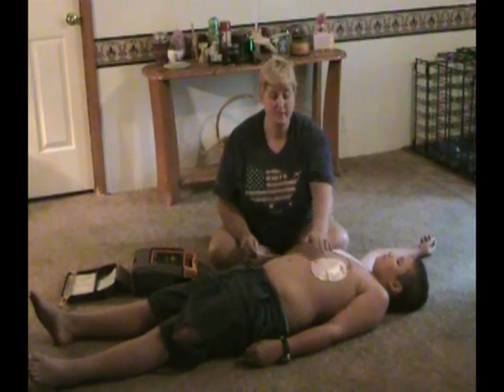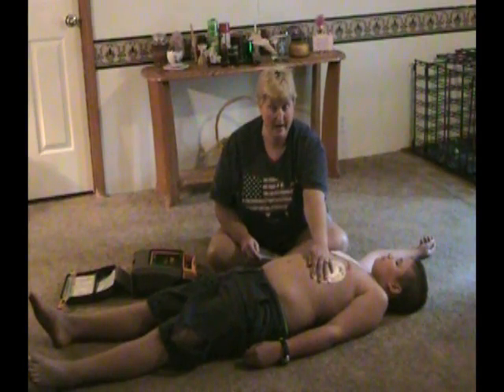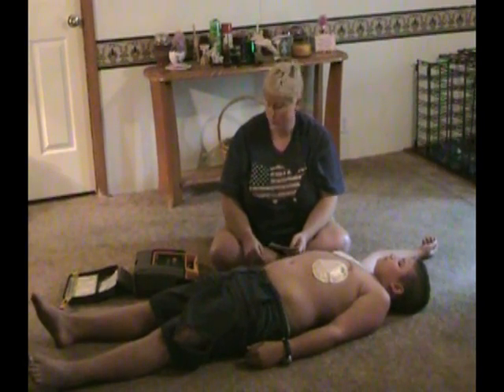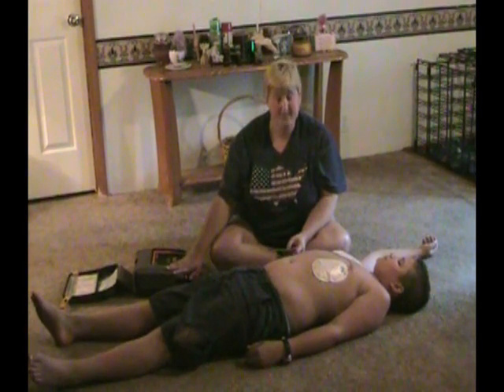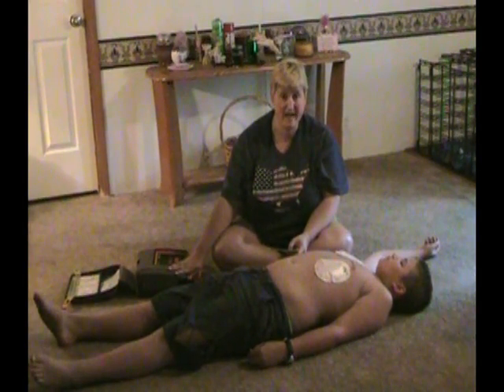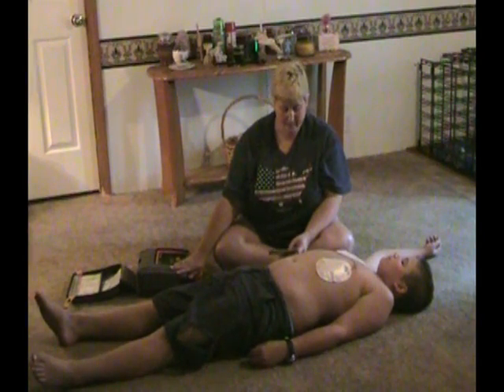You should not remove the pads. If you do revive the victim and they go back into cardiac arrest, it can be used again. Treating cardiac arrest with external defibrillation very quickly greatly increases the chances of the victim's survival. This is something the AED can do outside of a hospital setting.